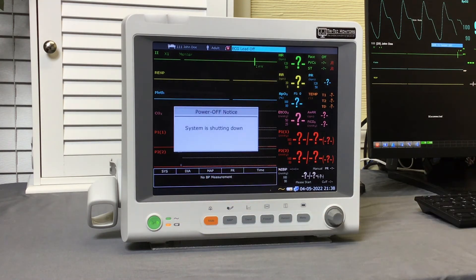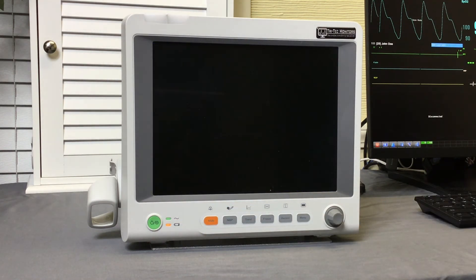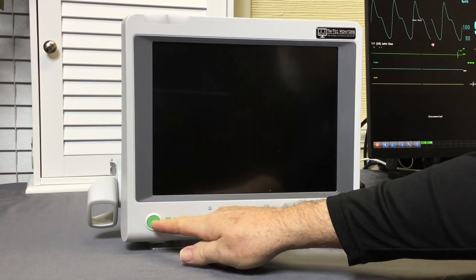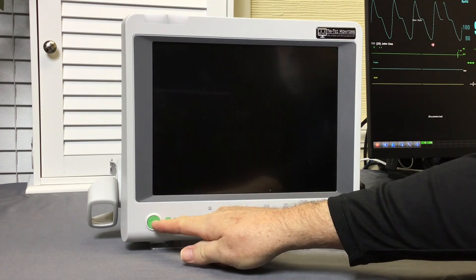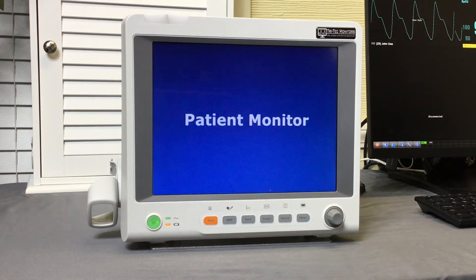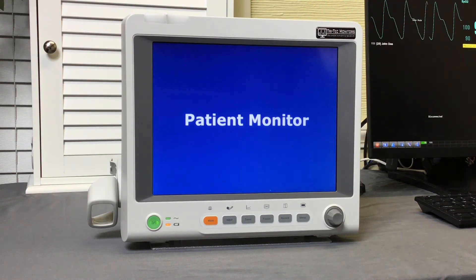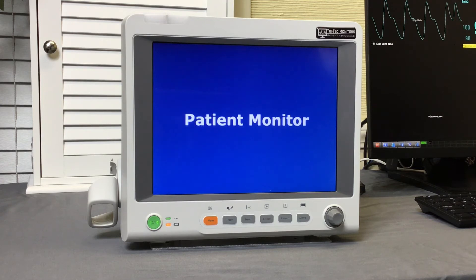This will ensure that the bedside reconnects to the strongest signal access point. This is especially important if your bedside is mobile on a rolling stand. In this case, restart the bedside in the actual room of the intended patient.